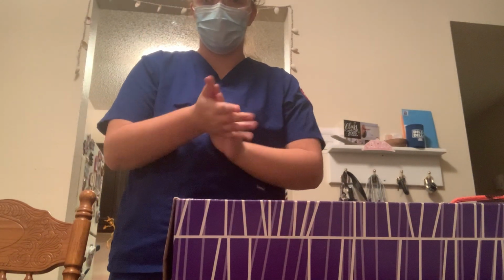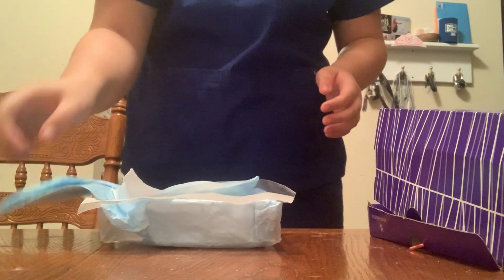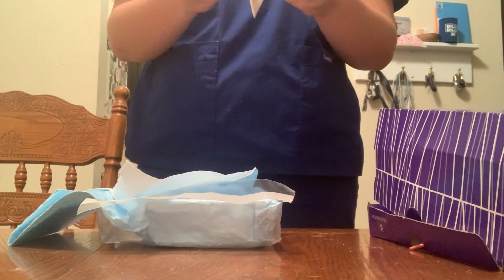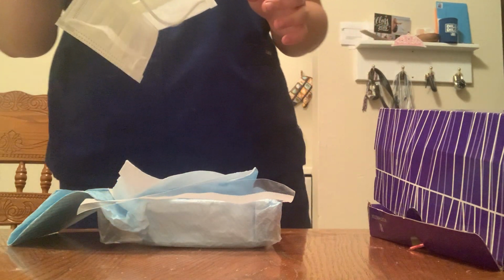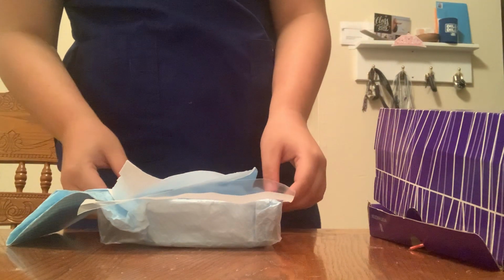And next I'll perform hand hygiene. At this point, I would put the mask on the patient before removing the old tape, in a real life situation, but we're not going to do that today. So the next thing I'm going to do is open the sterile field.